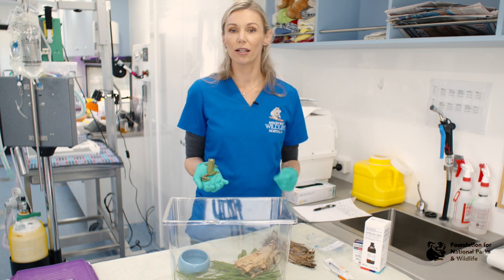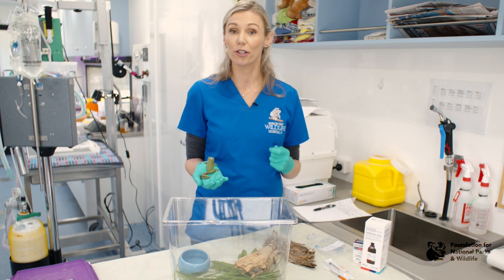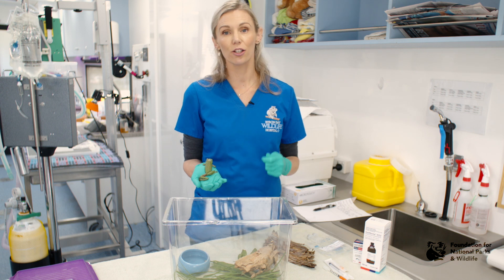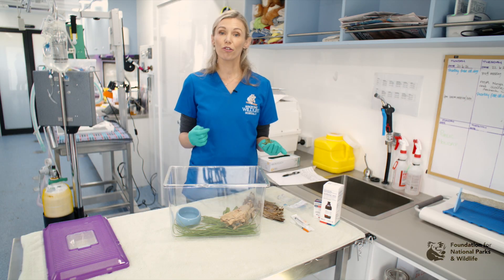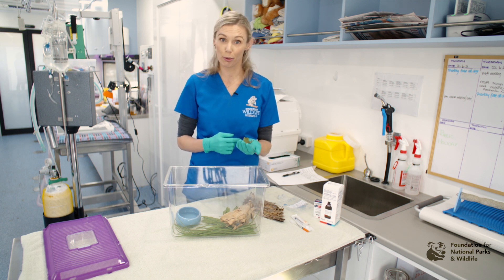To euthanise a frog, first anaesthetise your frog by the chosen method and then use lethobarb via the intracoelomic route. To ensure that your frog has passed away, check with a Doppler over the heart before disposing of the body.